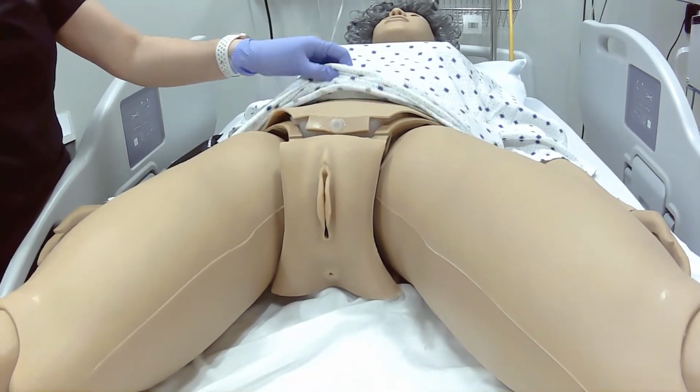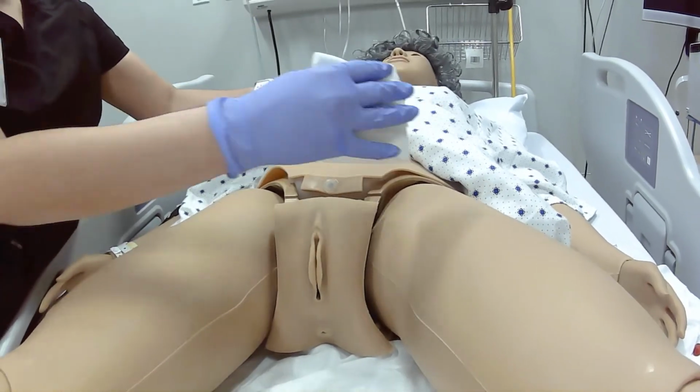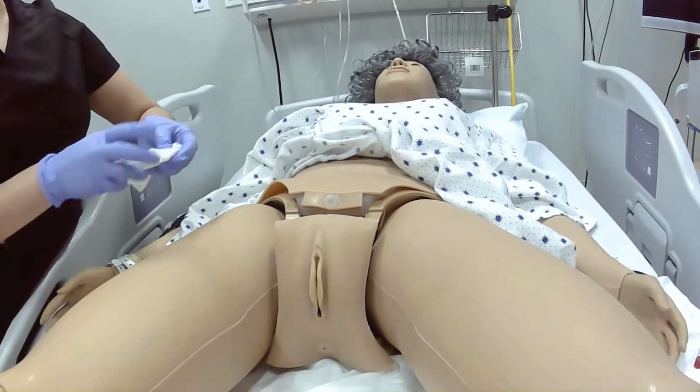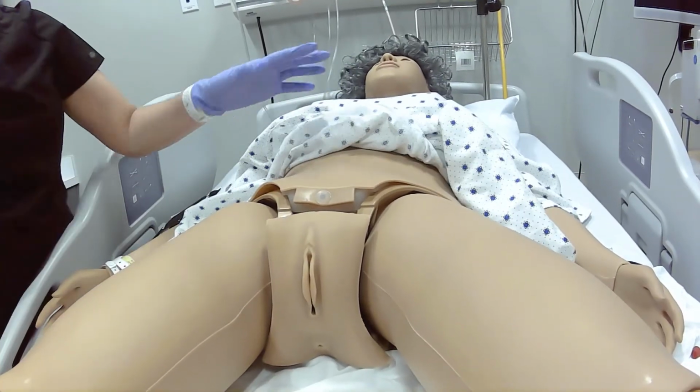Get a new wipe, and then you wipe down the abdominal region, okay, or lower abdominal region. So get another wipe, and if you need to, get another wipe and wipe down a little bit higher.